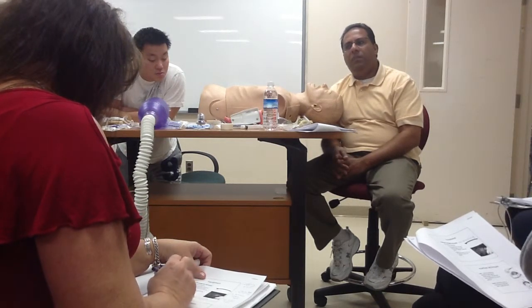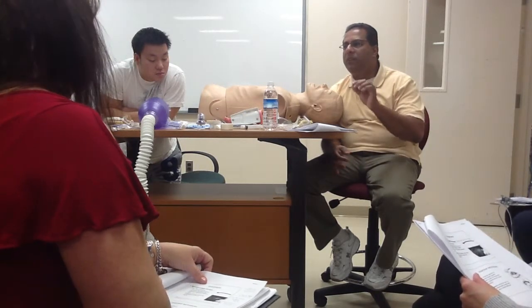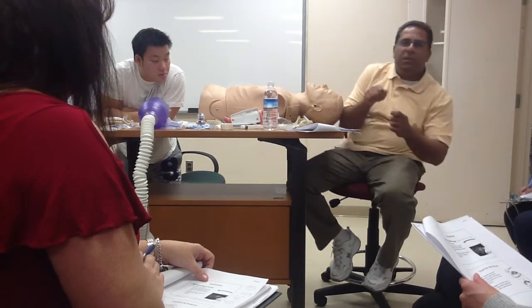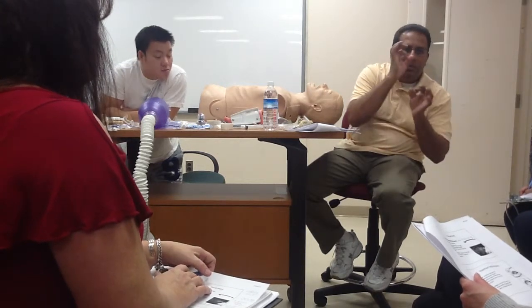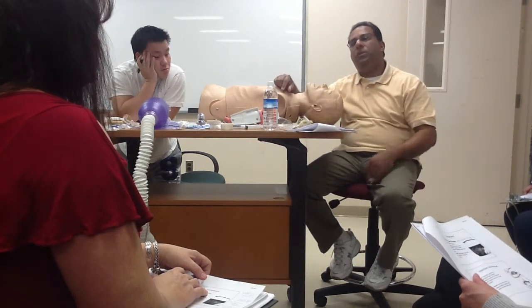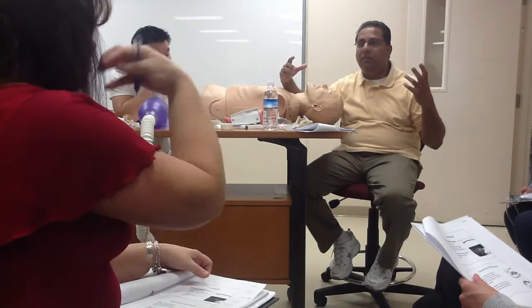A couple of things you have to remember with a nasopharyngeal airway: if you put a very small one in somebody, you won't be able to put that catheter down through it. Every time you attempt to suction, the catheter won't go down because of the smaller diameter. So you have to find the right size. That's a key. If you put it in too big, it's going to damage the nasopharynx.